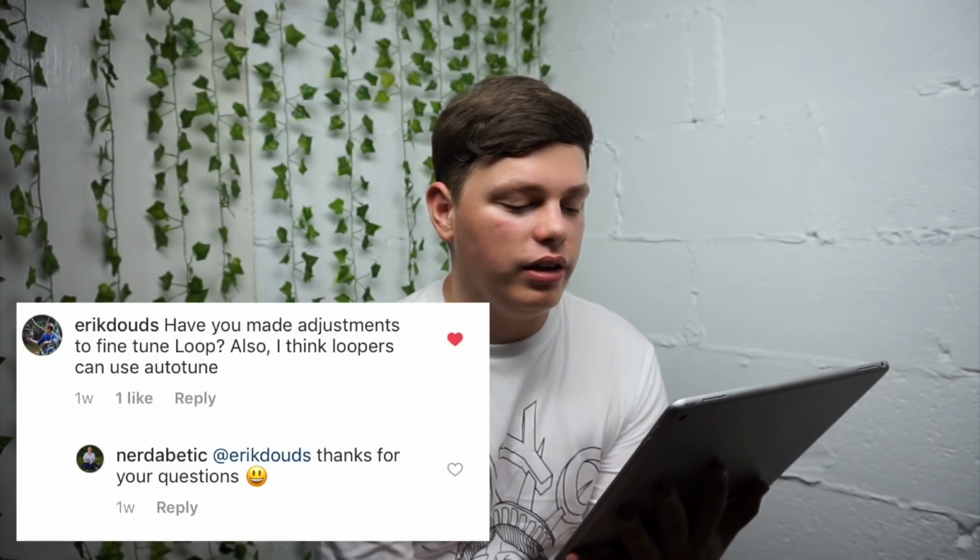So, yeah. Next question from Eric, another looper. Make sure you follow him as well. Have you made adjustments to fine-tune Loop? Also, I think loopers can use auto-tune. Yes, like I said before, I have. And in terms of adjustments, I have used the Spike version so we can work offline.